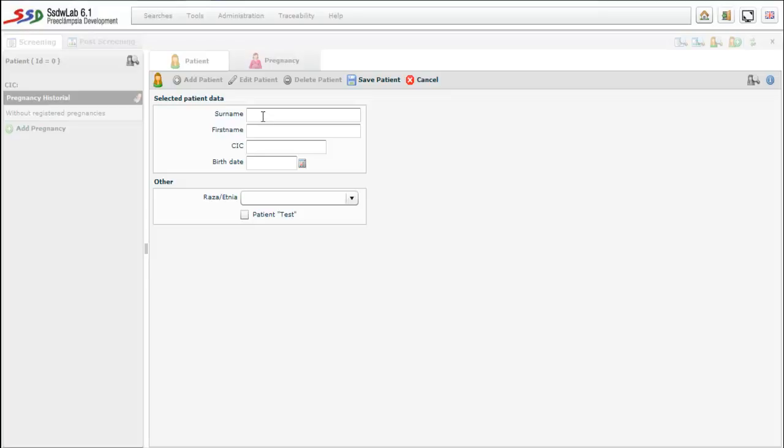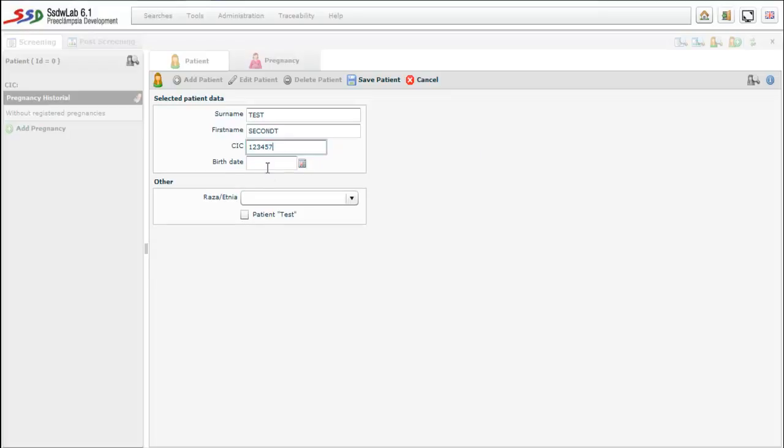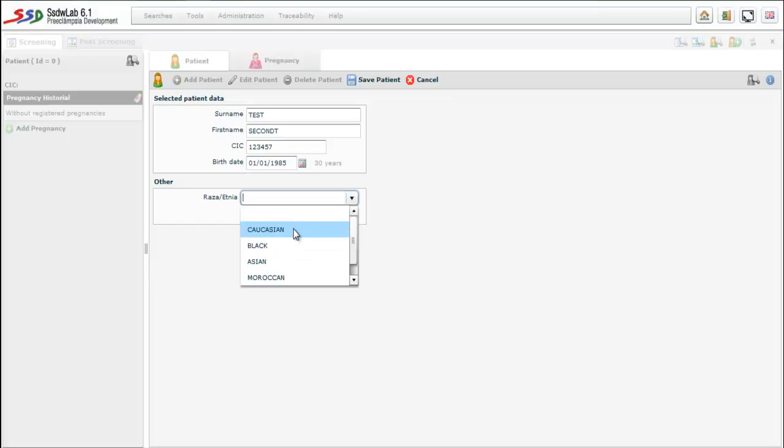In the patients folder we must enter the data identifying the patient: surname, name, CIP, and date of birth that will let us calculate the age of the patient. In the section called others, we introduce the race of the patient, which is a correction factor. In this case the patient is Caucasian.